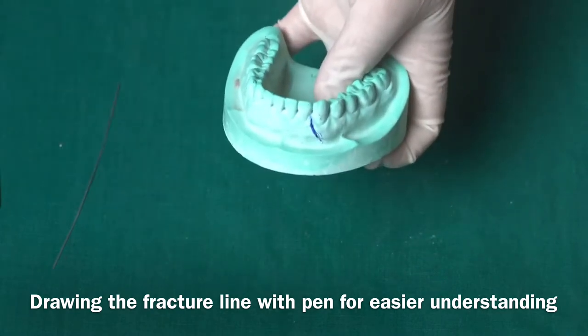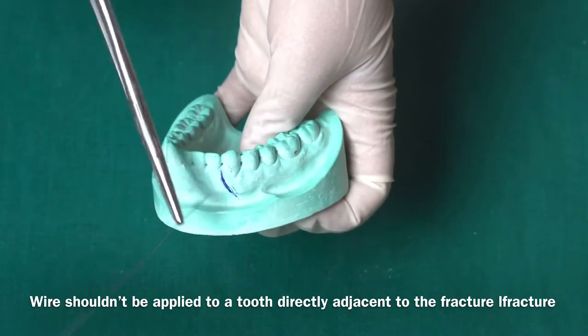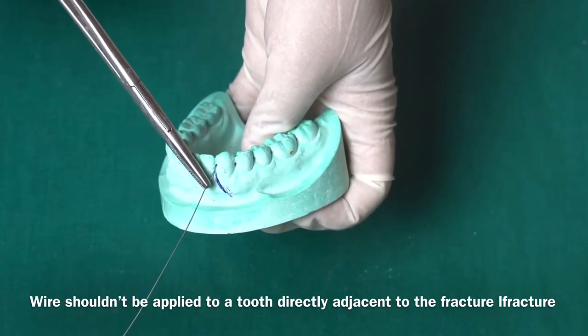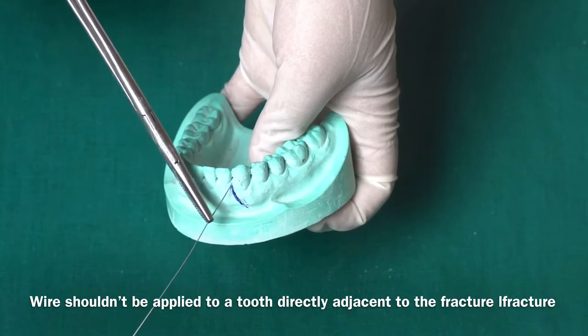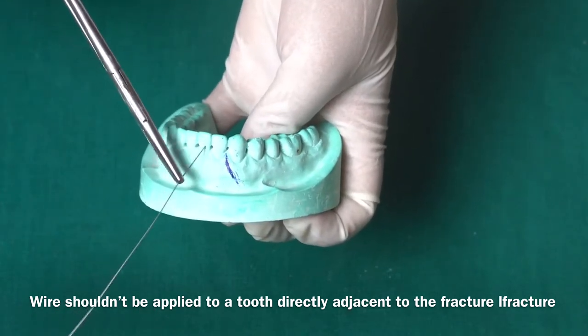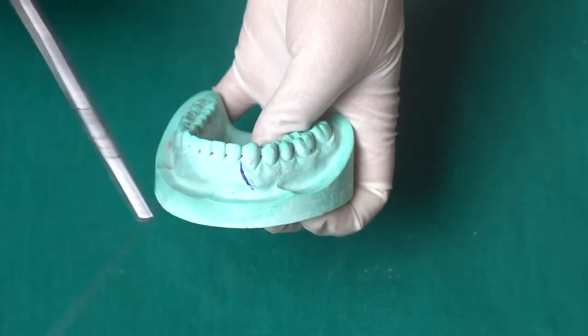This is the fracture line that I'm drawing with the pen. What you need to know is that wires should not be passed in the line of the fracture. For example, if the fracture is between the lateral incisor and canine, you cannot pass the wire in that region. You need to pass a wire that is at least one tooth away from the fracture line.